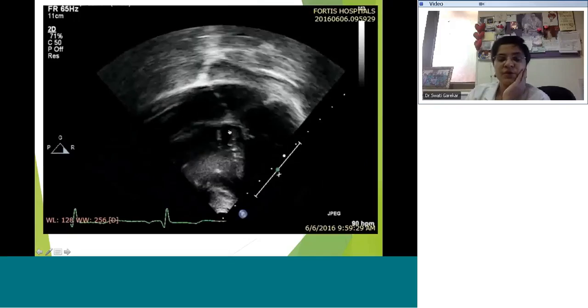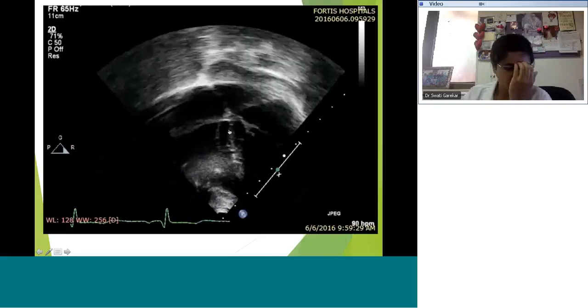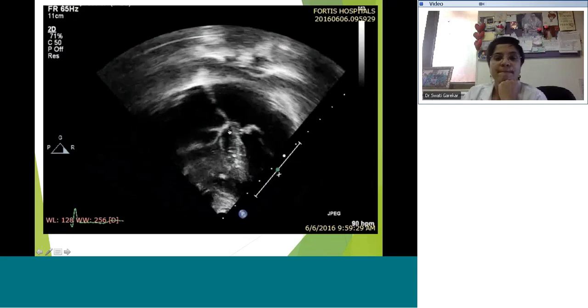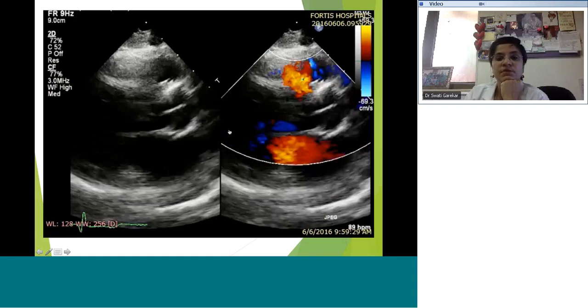Fish is correct. So supravalvar aortic stenosis is seen commonly in Williams syndrome. Can anyone tell me the correlation, if any, between hyperlipidemia and supravalvar aortic stenosis? While we look at these pictures.